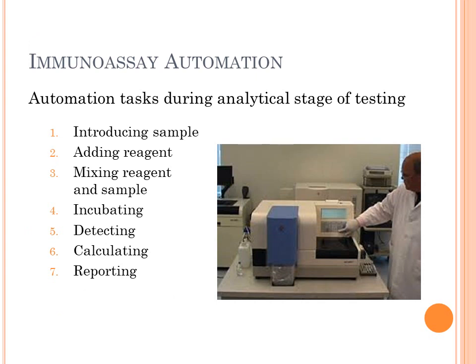These are basically the tasks that the instrument does for us as opposed to what we did manually years ago. So the instrument, once you put the sample into the instrument, it samples or sips the sample, if you will. It adds reagents, mixes them appropriately, incubates for the correct amount of time.